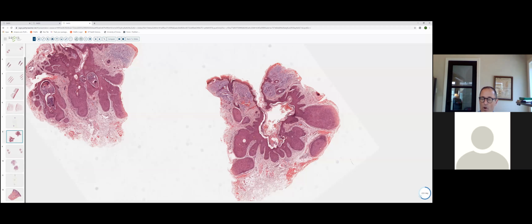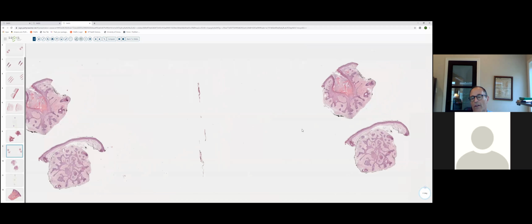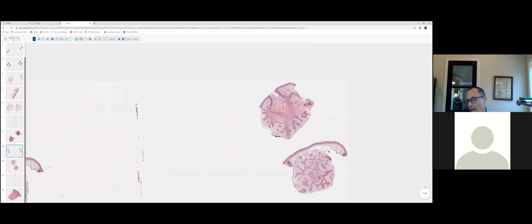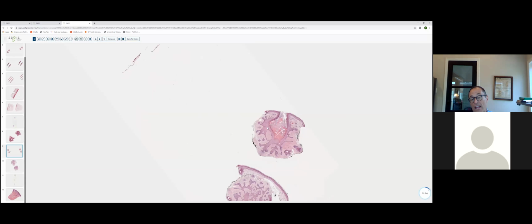do we see real well-defined secondary hair follicles. I mean, there's no hair shafts here, there's no inner root sheath, there's no bulb. So that's what distinguishes these two entities from the entity which we showed in slide 9. And I think we showed one of these in an earlier happy hour. And what we have in slide 9, again, is a punch biopsy. Then this again is from the face.